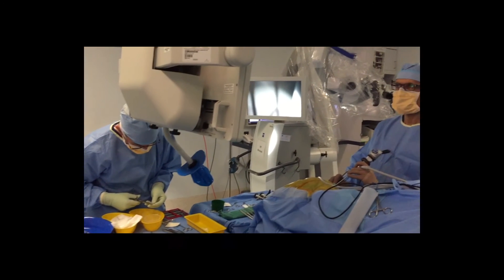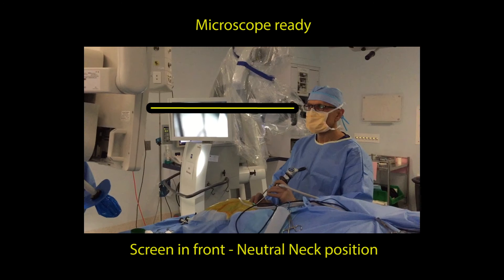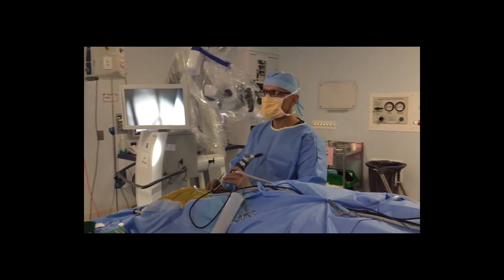The microscope is typically draped, as can be seen here, and there is a direct line of sight to the screen in front of the surgeon, allowing a neutral neck position.